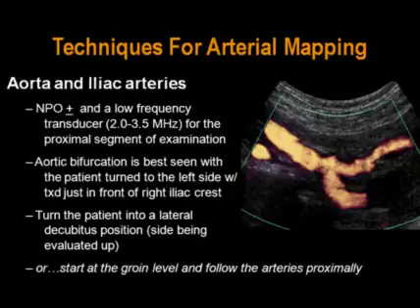NPO is a plus minus. We don't typically find that we need to have our patients be NPO. However, if that segment of the arterial system is gassed out, we will reschedule the patient after having the patient be NPO overnight. Typically, we use low-frequency transducers as these vessels tend to be deep for evaluating the proximal vessels.